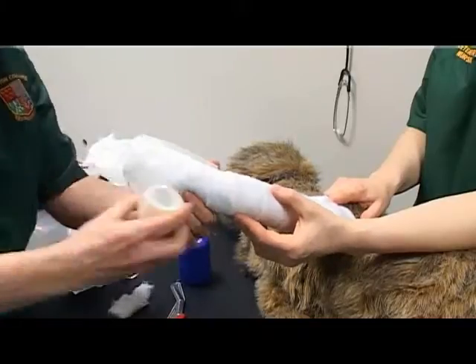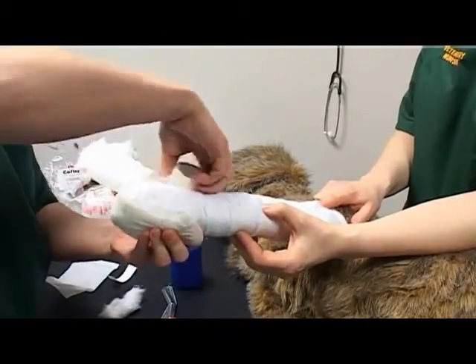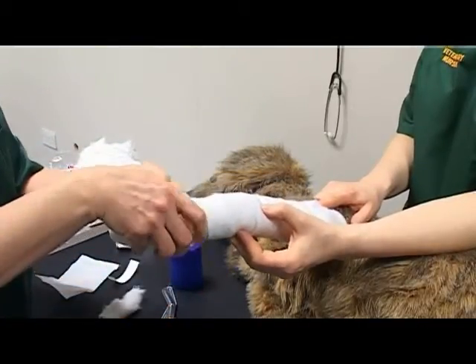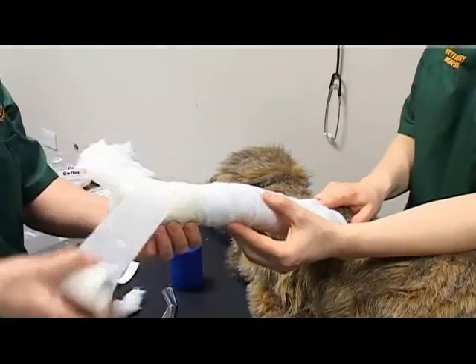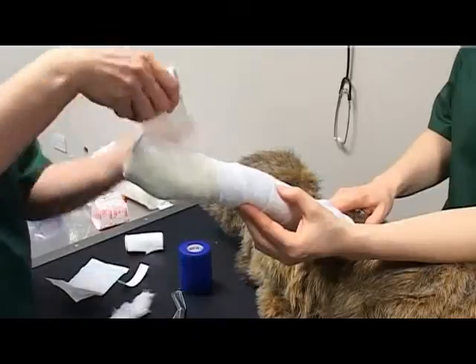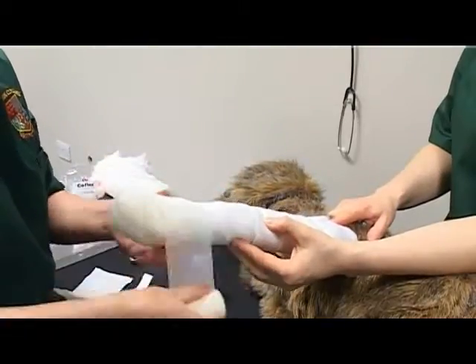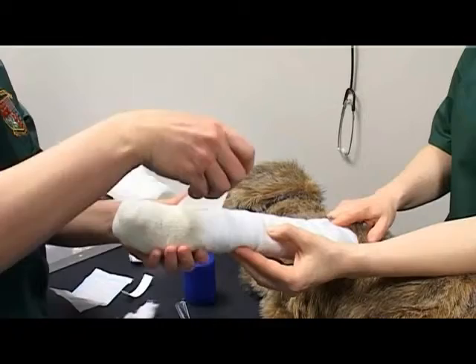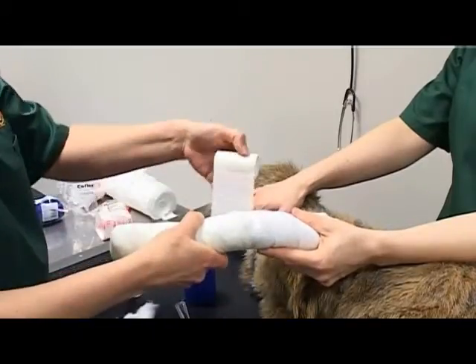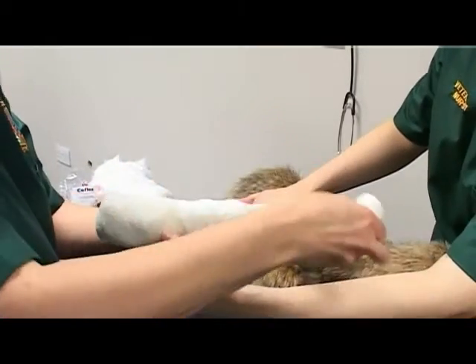Apply the conforming bandage, ensuring there is a reasonable amount of tension. Ensure the previous third of the layer is covered by the next layer of bandage, and again bandage distally to proximally, ensuring the foot and the elbow are included.